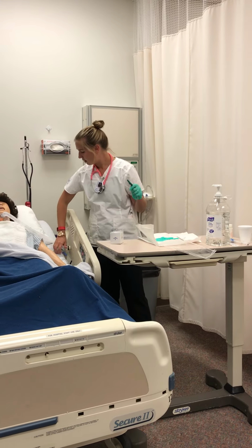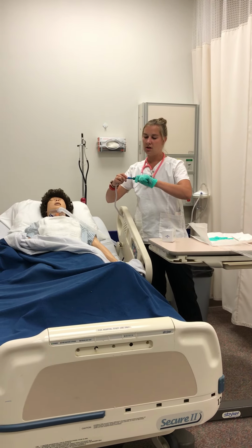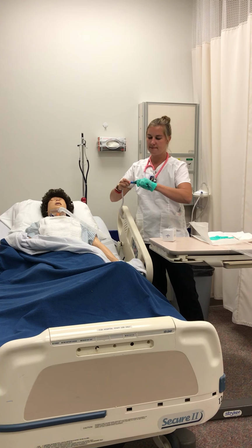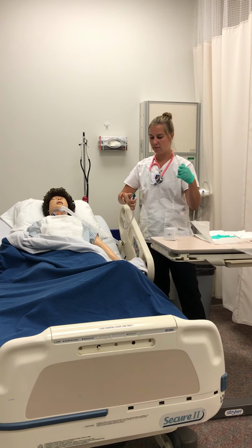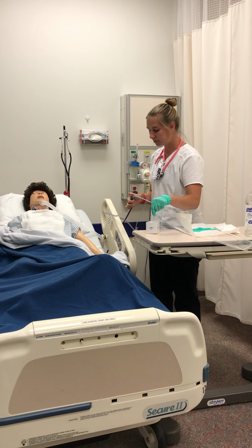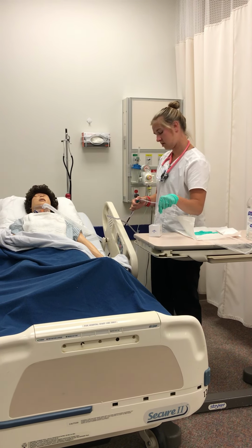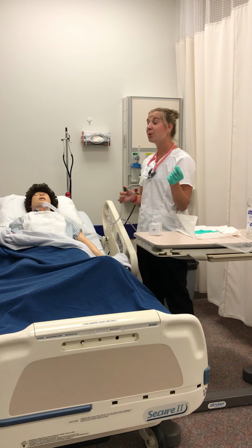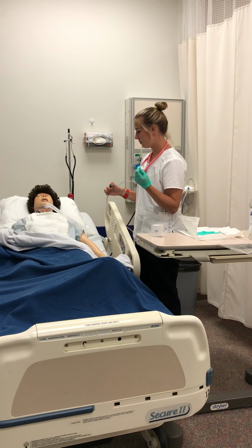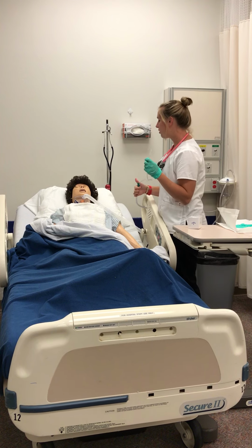All right, with my non-sterile hand, I'm going to grab the suction tube and attach to my catheter. And I'm going to suction a little bit of the saline solution and check the pressure, which is between the 100 to 200 range, which is normal. Great.